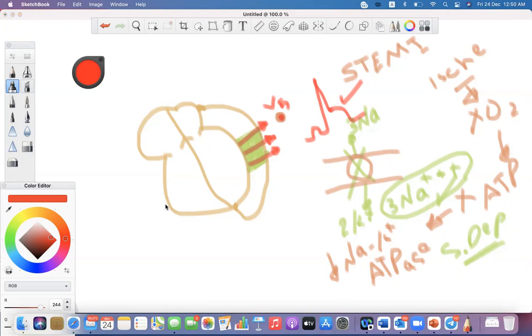And consequently, the opposite or mirror image leads will show ST segment depression, what we call reciprocal depression, something like this. So when there is a transmural infarction, there is marked increase in the electrical activity and depolarization of the whole muscle, causing the electrical axis to go from the endocardium towards the epicardium, towards the lead. So it causes ST segment elevation.